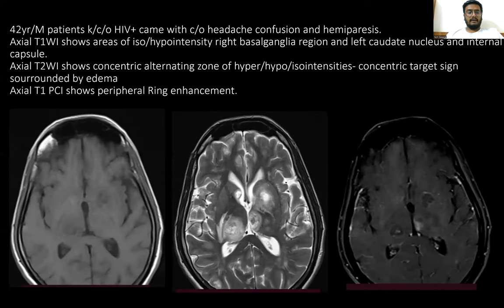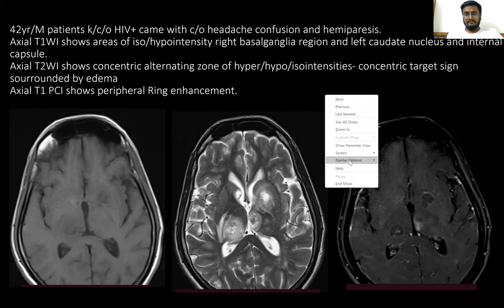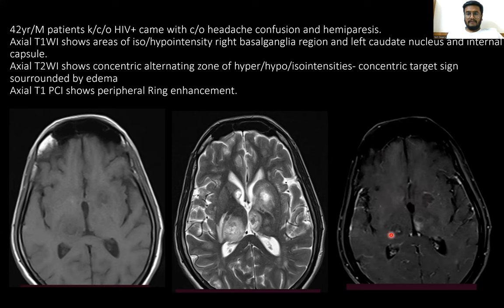Here is the first case: a 42-year-old male, known case of HIV, presenting with headache, confusion, and hemiparesis. On axial T1-weighted images, there is an area of hyper-intense lesion in the basal ganglia region, left caudate nucleus, and internal capsule. On axial T2-weighted MRI, there is a concentric alternating zone of hypo-, hyper-, and iso-intense signal, known as the concentric ring sign, surrounded by edema. On axial T1 post-contrast, perilesional edema and ring enhancement are seen.